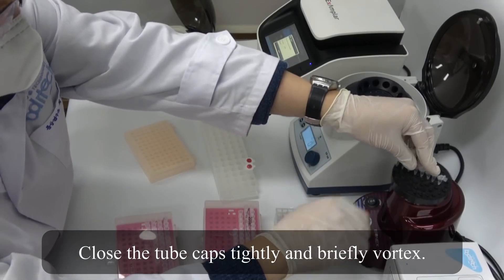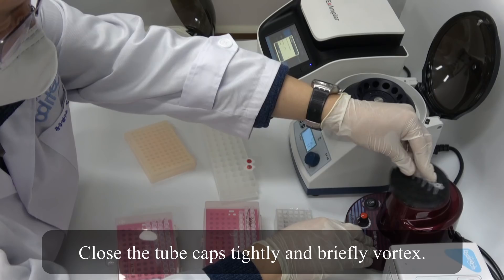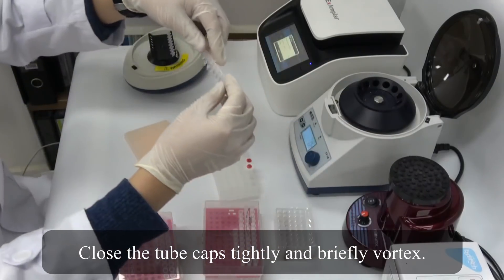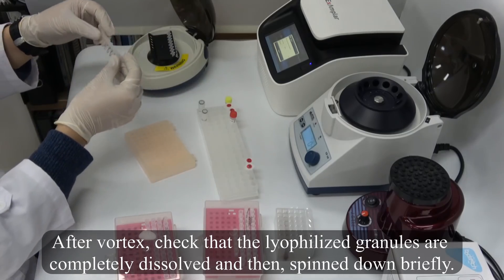Close the tube caps tightly and briefly vortex. After vortex, check that the lyophilized granules are completely dissolved and then spin down briefly.